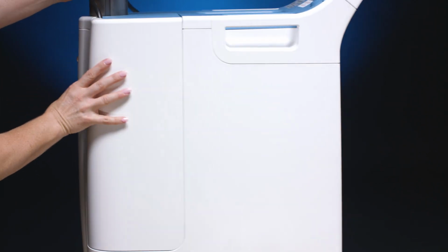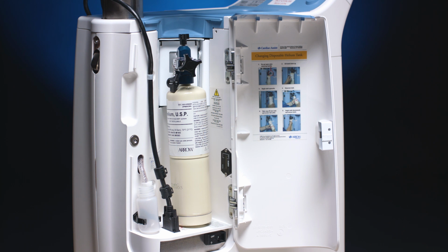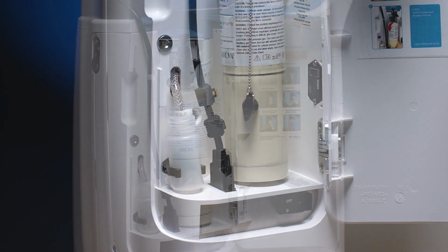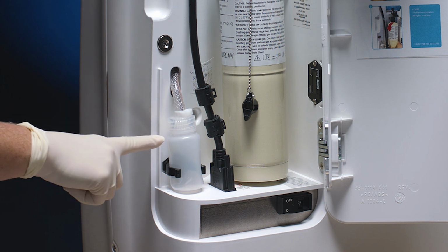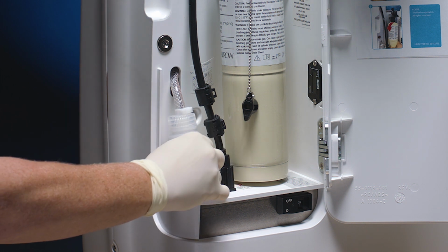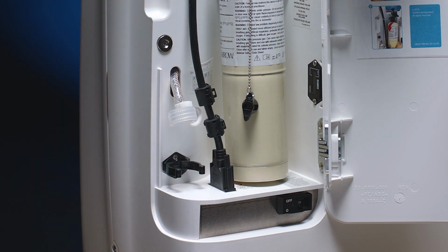The compartment located on the left rear of the pneumatic drive module houses a 500 psi disposable or 2000 psi refillable helium tank. The AC3 Optimus IABP also has a thermoelectric baffle system to condense and remove moisture from the pneumatic lines. The liquid drains into a condensation bottle located in the helium storage compartment.